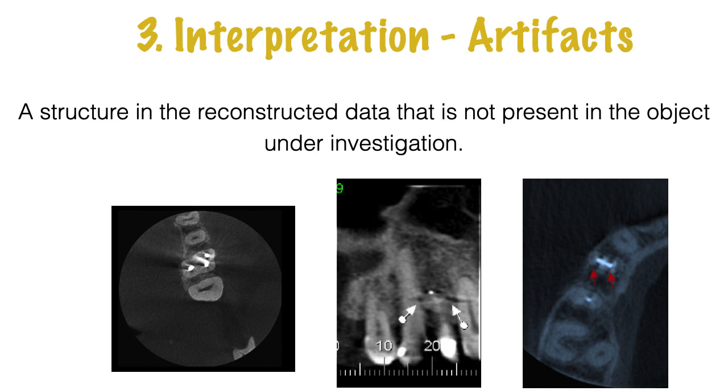The image on the right, you see we're looking here at the premolar with the crown, and when we look at more apical area, there's a very lucent round area there, and then there are artifacts there that look like there's a fracture there, but it's artifacts.